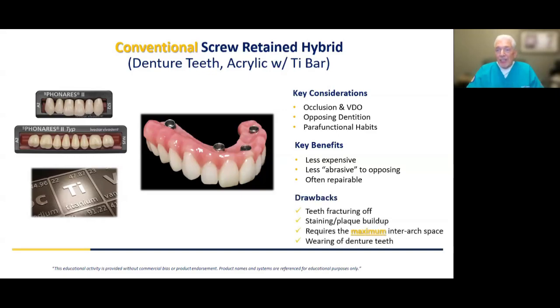Drawbacks: I've just mentioned some possible teeth fracturing, staining, plaque buildup. It does require more inner arch space, and the teeth do wear. But once again, that could be a good thing. But it's not a good thing if you don't let the patient know that. Five, six years down the road, they've lost some of their anatomy, they've worn that down, and their mastication is compromised because it's just flat surfaces trying to chew food, as opposed to having cusp-fossa relationships. So again, it's not a bad thing, but communicate that to the patient so they understand.